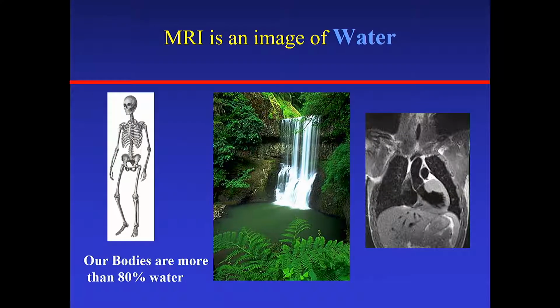Many of us will think of MRI as the imaging of water, because our body is made up of 80% water. So the water in cells or in any structures gets activated by MRI. But in fact, it is not really the water. It is actually the proton that is attached to any molecular structures in the body.